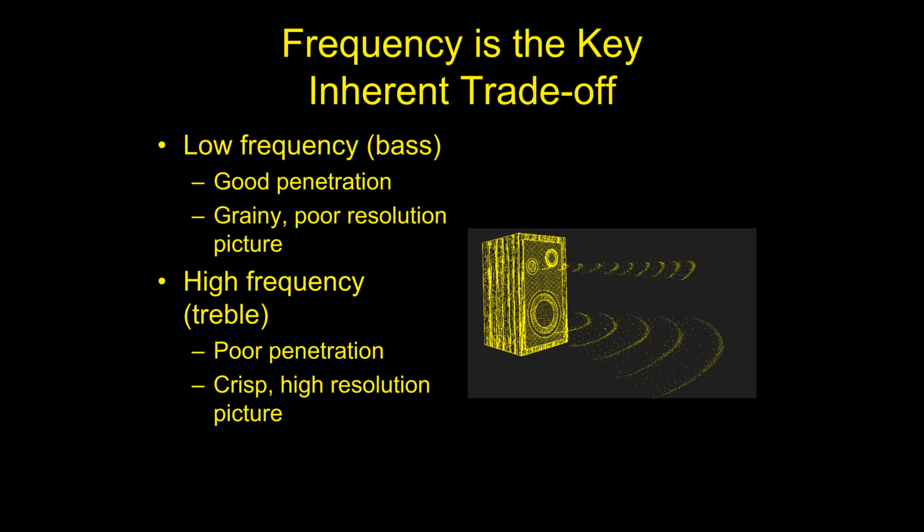On the other hand, if you have a high frequency probe, the picture is going to be really pretty. It has good resolution, but it doesn't penetrate very far in the soft tissues. And that's a physical trade-off, just due to how the physics of how the sound interacts with the body, that you can't get around. Okay. So it's one or the other. And so there's a compromise depending on what you want to do.